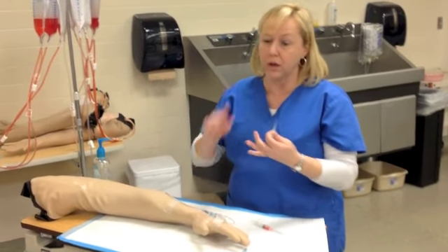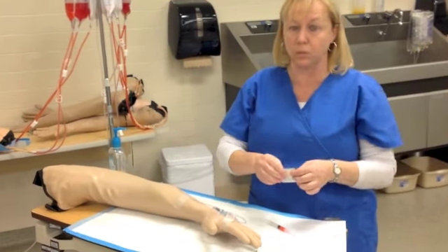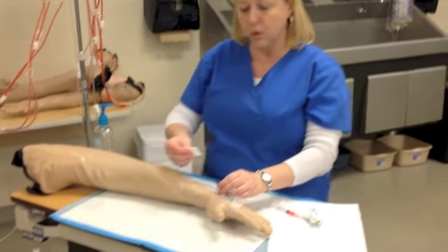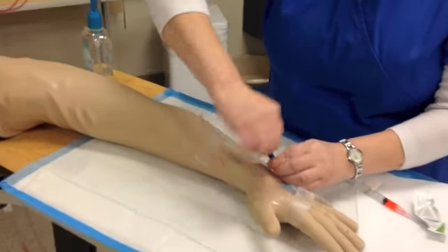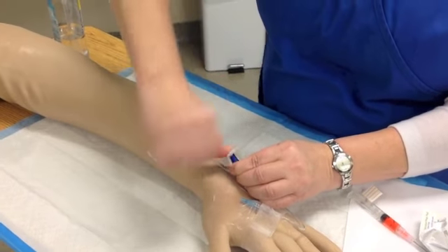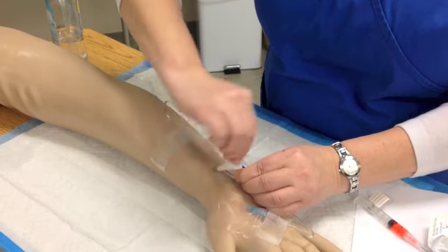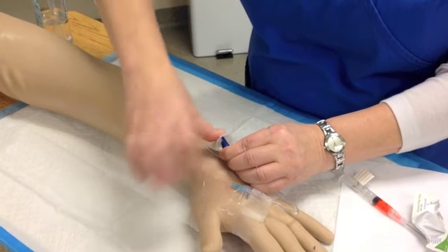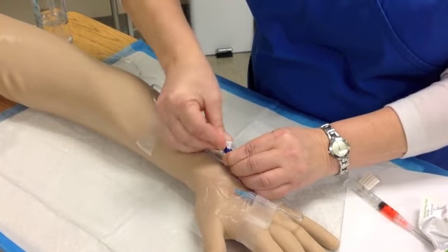So we've verified allergies, we know we have the right patient, we know we have the right meds. So we're going to clean our port, and when we clean it, we're going to clean it kind of round and round, not up and down and back and forth, because this tubing is round, and really clean it because this has been laying against the patient's arm. So we go ahead and clean that again for about 30 seconds, just like we do any other site.